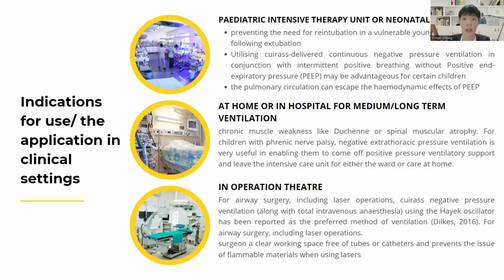Besides, in the operation theater, it also gives a surgeon clearer working space, free of tubes or catheters, and prevents the issues of flammable materials when using lasers during an airway surgery or laser operations.